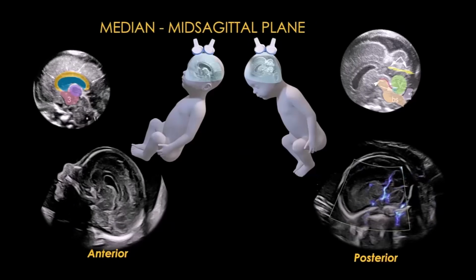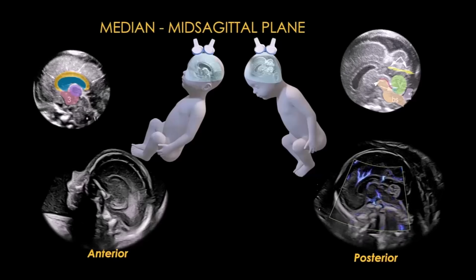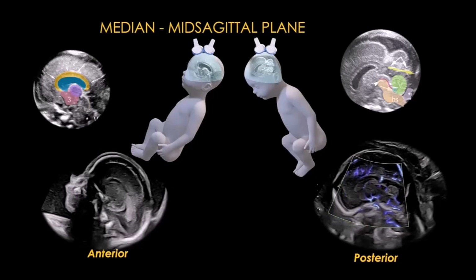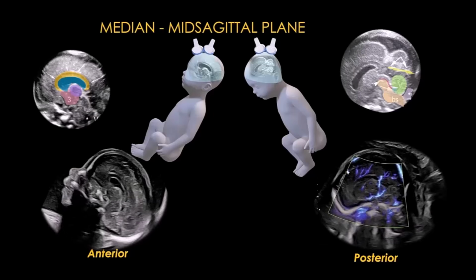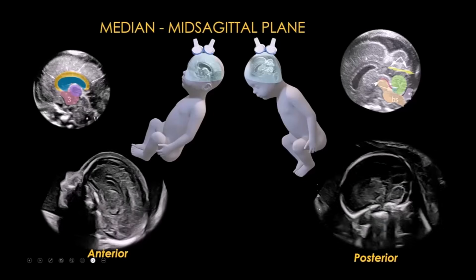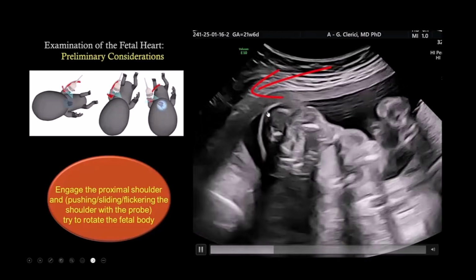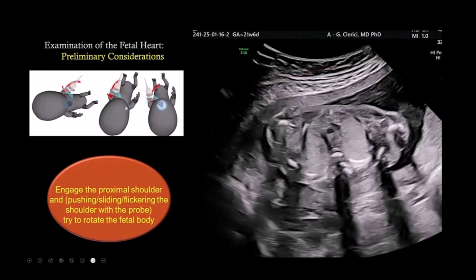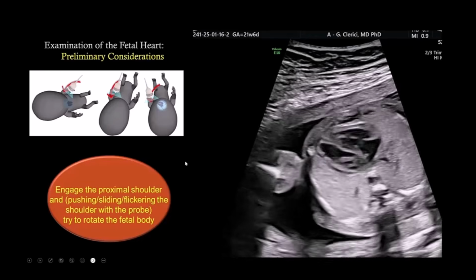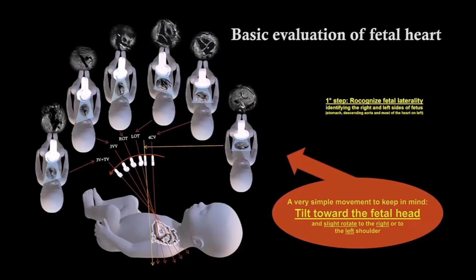The course follows a clear step-by-step methodology, helping you understand not only what to look for, but also how to look. From the fetal brain and face to the heart, thorax, abdomen, spine, limbs, placenta, uterus, cervix, and circulation. Each topic is presented with a practical clinical perspective, focused on image acquisition, anatomical assessment, and everyday diagnostic performance.